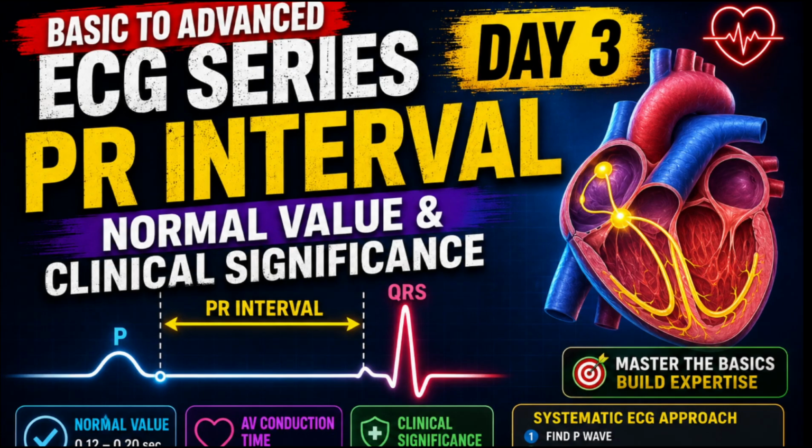So, in day one, we learned about ECG basics and lead placement, and in day two, we learned about the P wave and atrial depolarization. Today we will learn one of the most important intervals in ECG interpretation: the PR interval. If you understand the PR interval properly, you can easily diagnose heart block, pre-excitation syndrome, and conduction abnormalities. So, without wasting time, let's start from the basics.